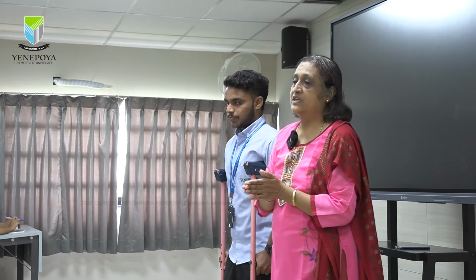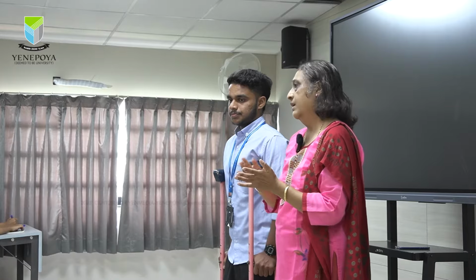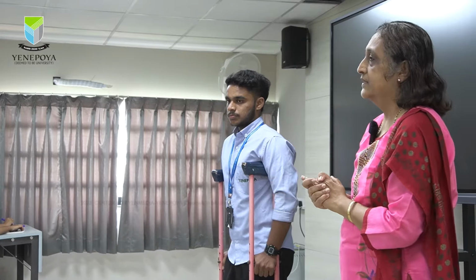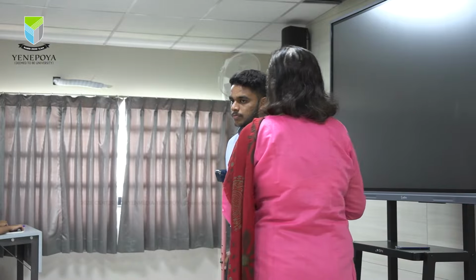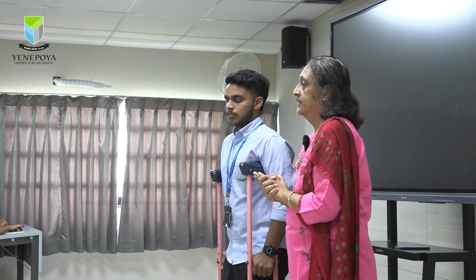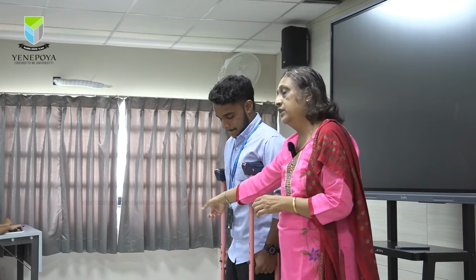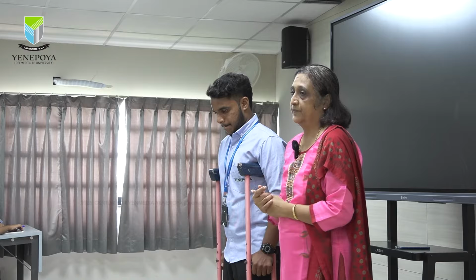That means the energy conservation with the patient is much better than the opposite. So, these are the 2-point crutch patterns. Now, a third pattern is also there for the auxiliary crutches, that is the 3-point gait. Now, what are the 3 points? The 3 points are again 2 points of the 2 crutches and also 1 point of the 1 leg.